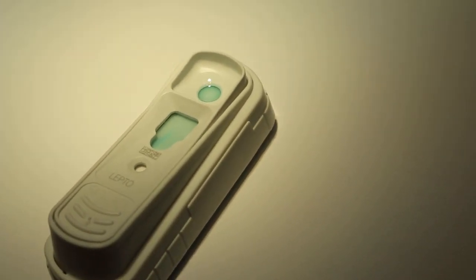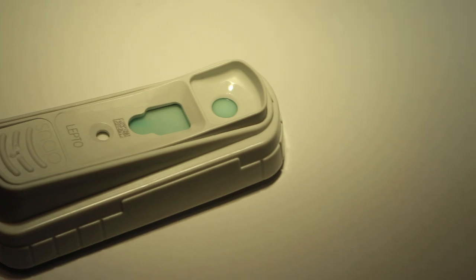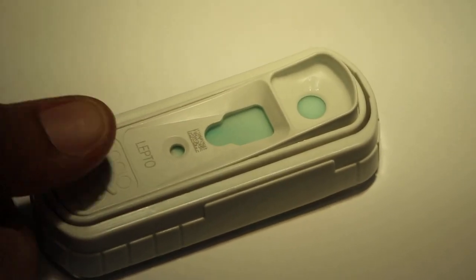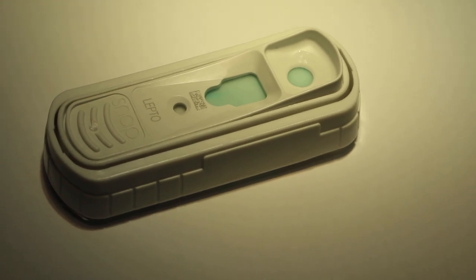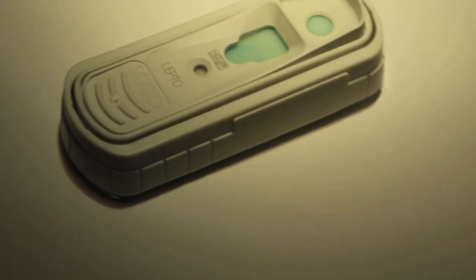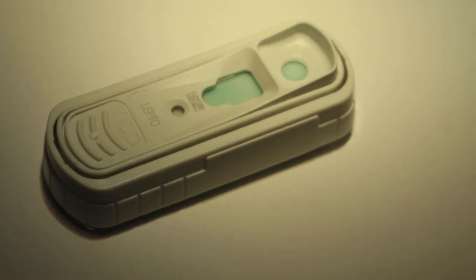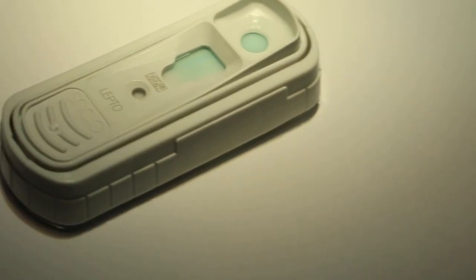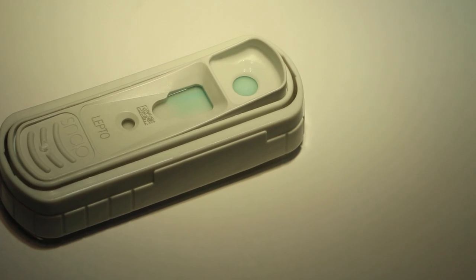When the color first appears in the activation circle, push the activator firmly. It has reached the circle already, so press firmly. Keep it horizontal. Read the test result at 10 minutes. The time is 6:10, so the result will be at 6:20.